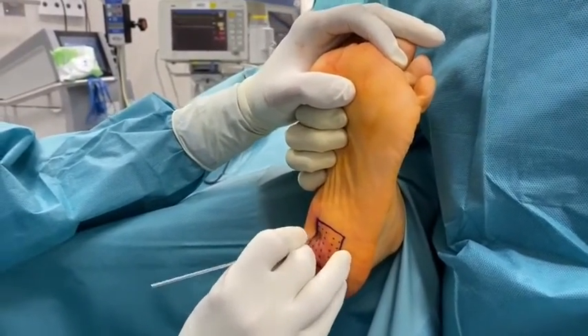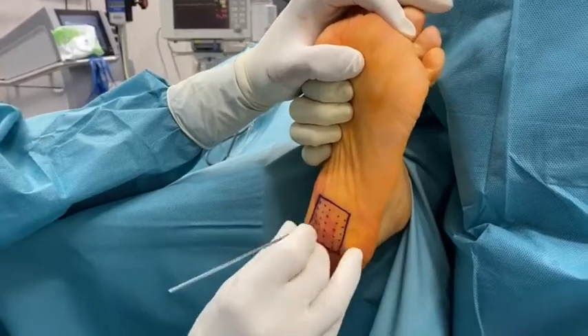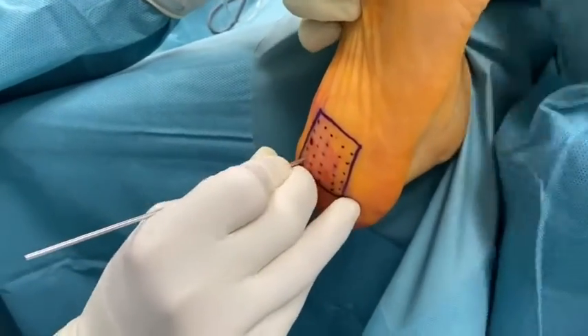Radiofrequency skin entrance points are punctured with a 1 to 1.5 mm Kirchner wire.